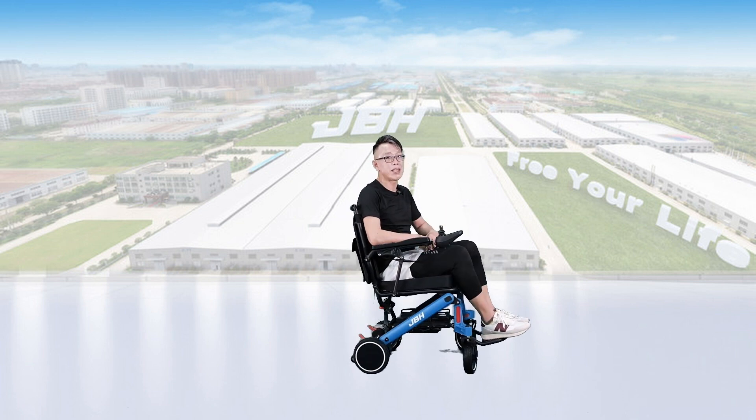You can even perform a 360-degree point turn with no power issue at all.